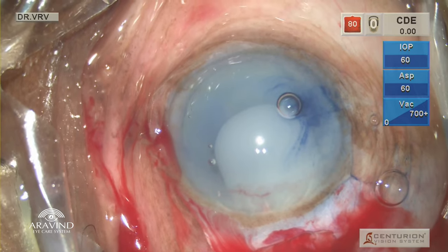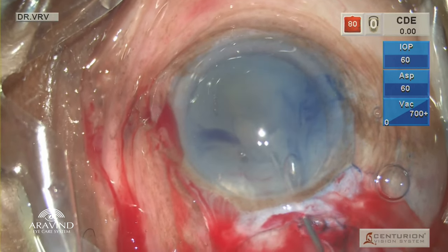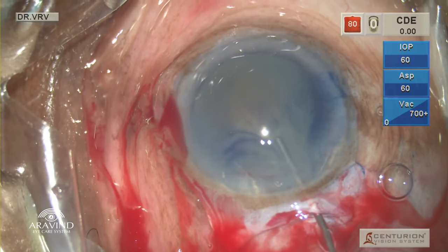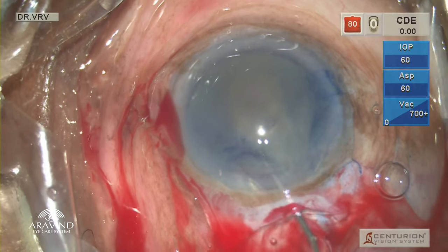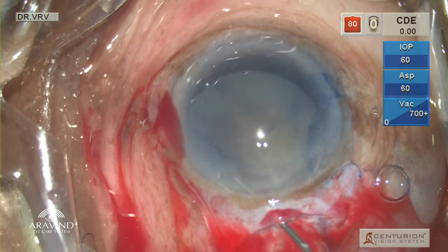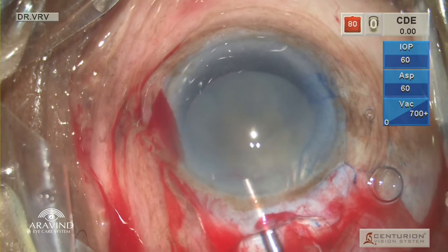You have a lot of cortical fluid draining out. Using balanced salt solution, it is gently flushed out of the bag without overfilling the bag. A mobile nucleus is always an indication that the posterior capsule is intact. Once the cortical fluid is drained, HPMC is injected into the anterior chamber completely.